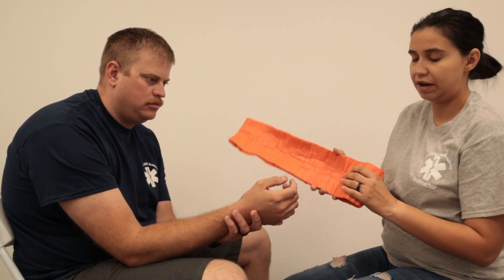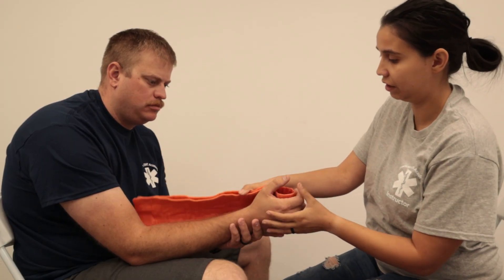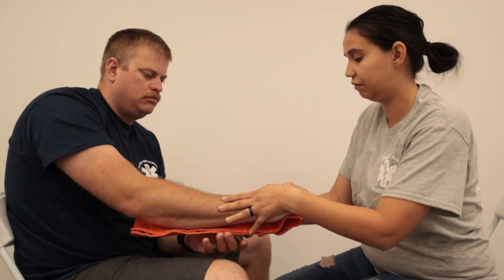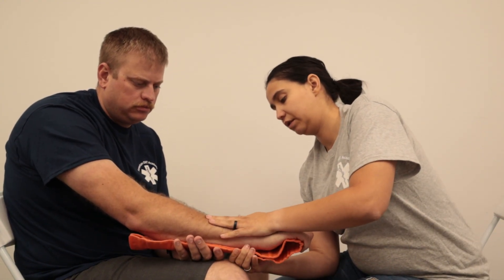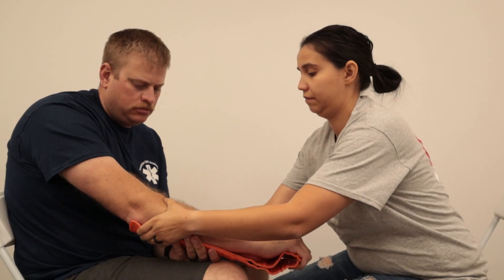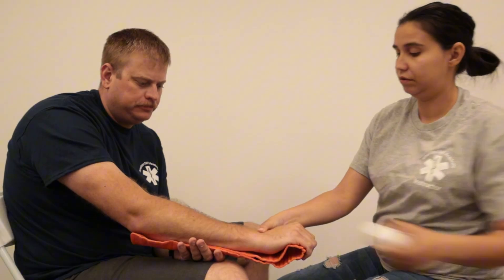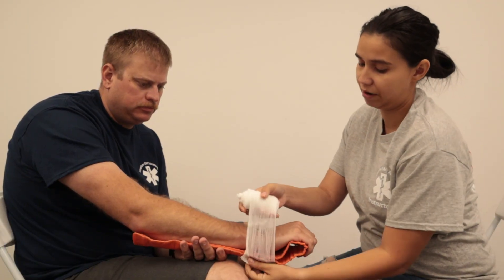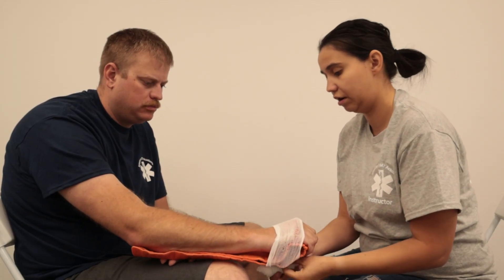I'm going to put this rounded edge where he can grip it. I'll lay this against his arm — if you can rotate it like this, I'm going to help conform it a little bit more to his arm. Is this at a good resting position for you? Once that's good, we're going to start wrapping it, always starting below and working up.